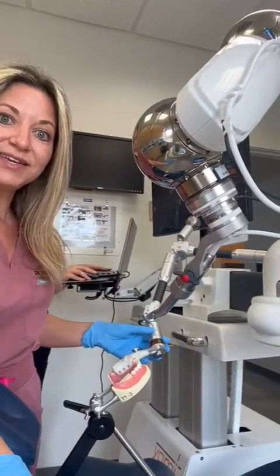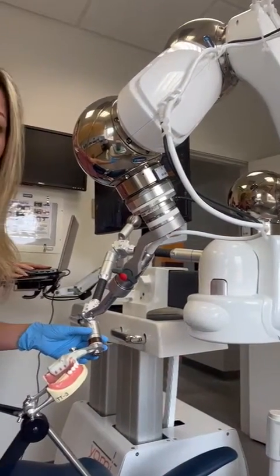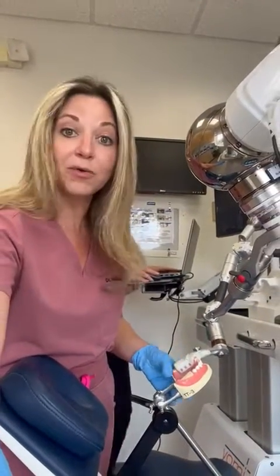Hey everyone, it's Dr. Herzog from Implant Center of Miami and I'm here to show you the newest and latest technology that we have. This here is the Yomi robot and this robot is actually a surgical assistant to the doctor, and this is going to allow us to place the implants more precisely than we already do.